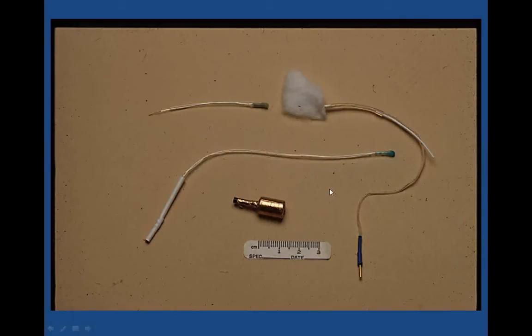And of course, these are all extratympanic recording approaches. Many countries in Europe, Japan, and Australia still prefer the transtympanic approach, where you actually deaden the eardrum a bit and stick a needle through it to rest it on the promontory. That approach has not been well accepted in America for a variety of reasons, not the least of which is we like to get people to come back for second tests sometimes.